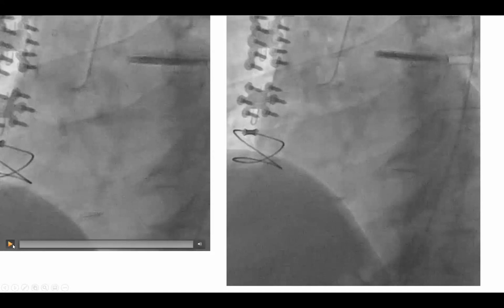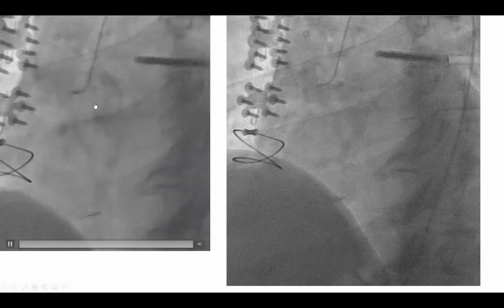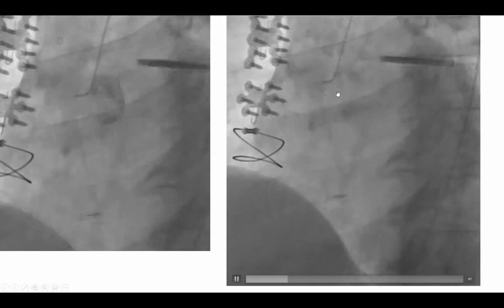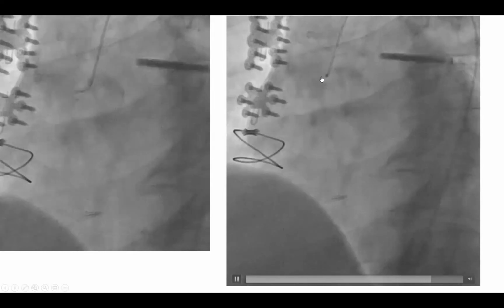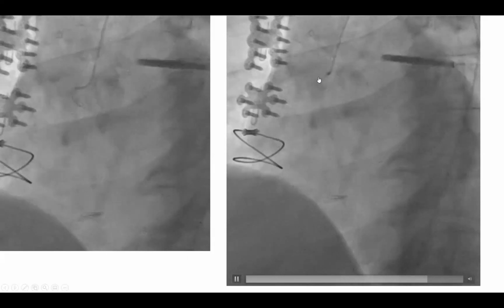Okay, this is another illustration here. And again, you can see here, I want you to recognize that on the non-selective puff, you see that sinus of Valsalva, you see that nest, you're too low. Again, the catheter has been clocked and pulled, but it came too low. So this is what was done here. It was counterclocked slightly and pulled gently, and look, it nicely engaged. So usually you counterclock and pull, and usually with a little clock, and you engage.